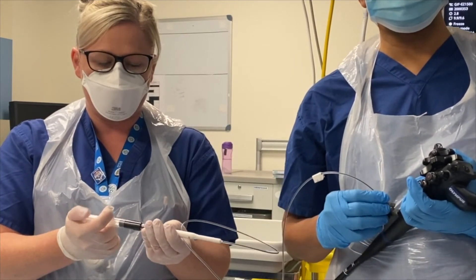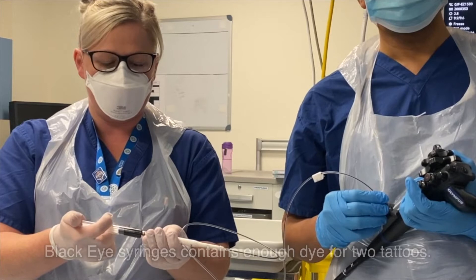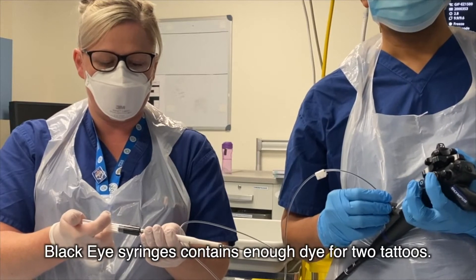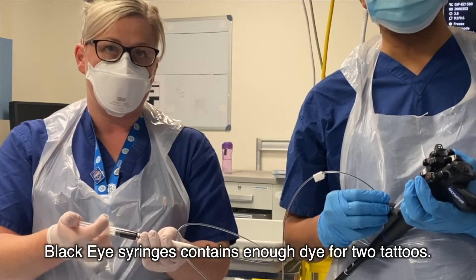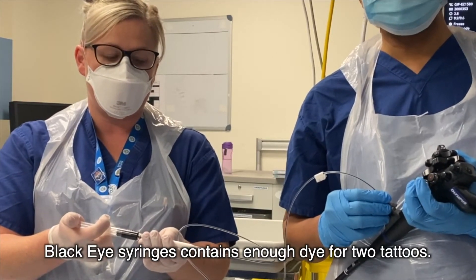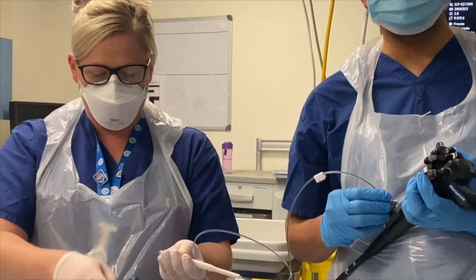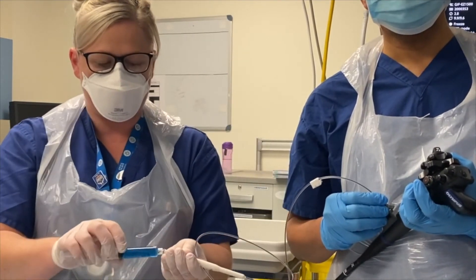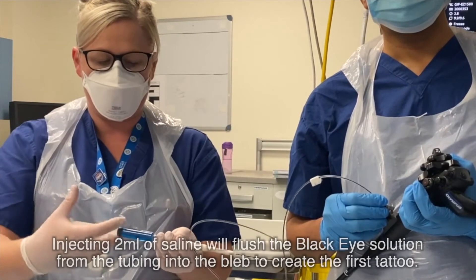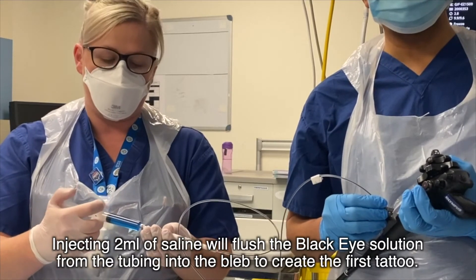Just inject 2ml please. Stop at 2ml. Just short 2ml — okay, 2ml. Now change the syringe back to the normal injecting solution, keep the needle in, and inject another 2ml flush.